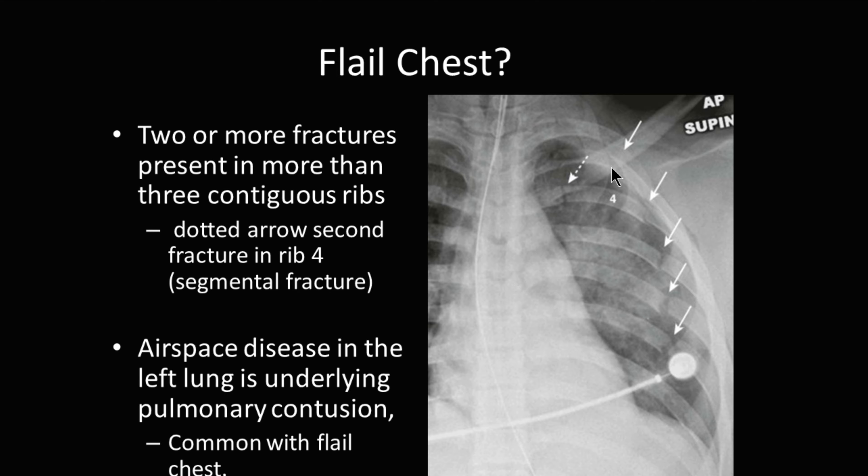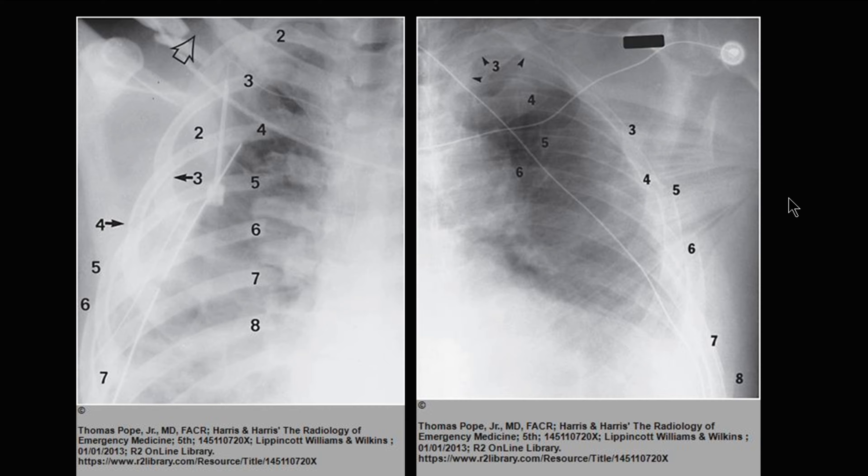Along with this, you can have pulmonary contusions from these ribs being broken, both with flail chest and with rib fractures. To show a good picture of what a flail chest looks like, you can see a fracture here and here on the third rib, and the fourth rib, fifth and sixth.